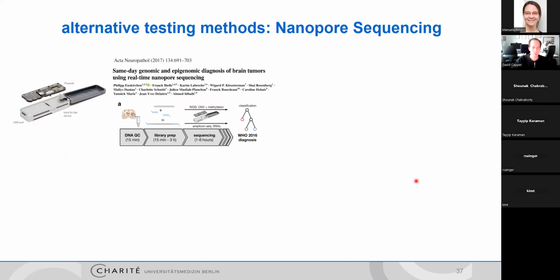You can also identify other such groups attached to bases, but the most commonly used is whether a cytosine is methylated. This can be predicted, meaning that you suddenly have a sequencing method that allows us to do DNA methylation profiling. It also clearly has some disadvantages.